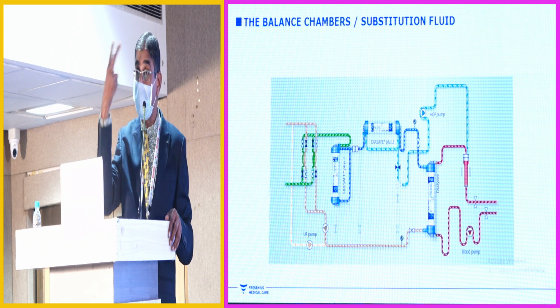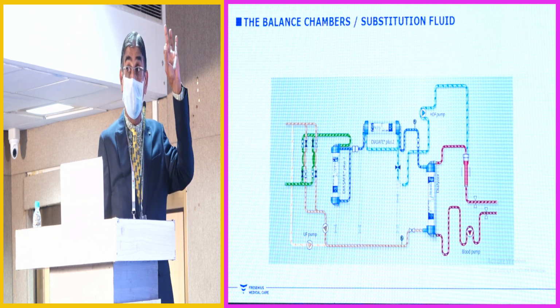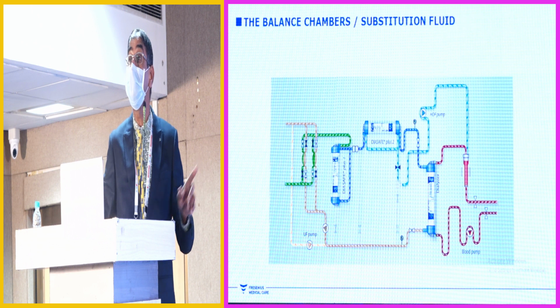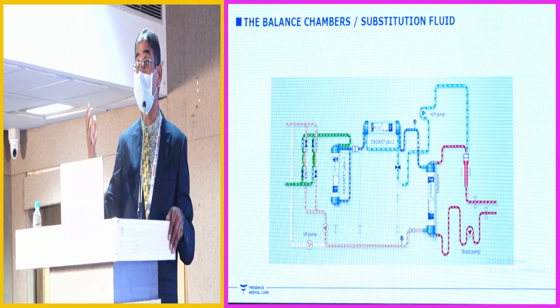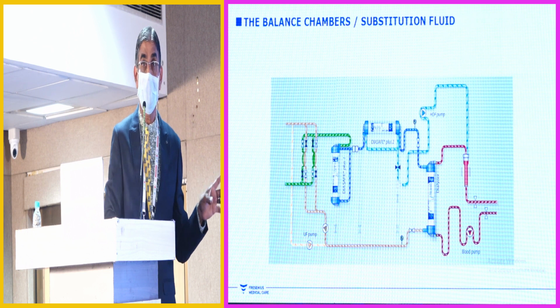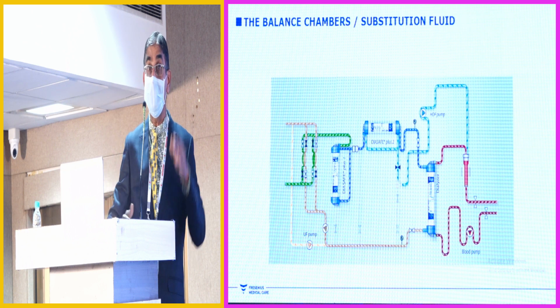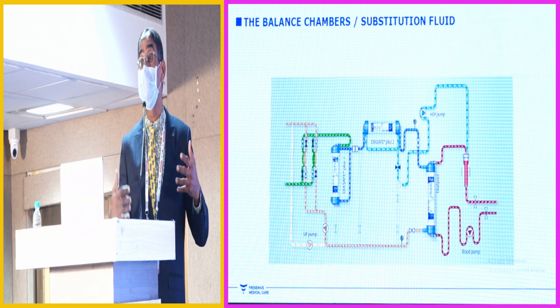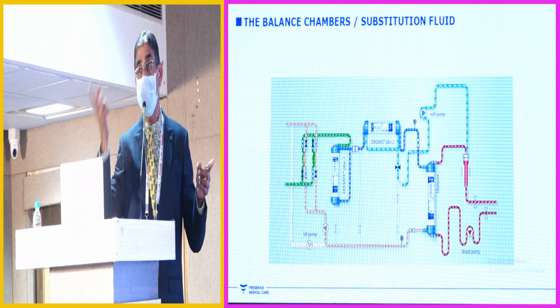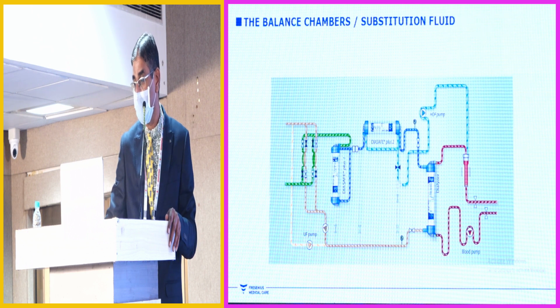What comes out of the second endotoxin retention capacity filter, the pore size is 0.2. After it comes out of the second endotoxin filter, it is going into this as a substitution fluid or a replacement fluid into pre-dilution or post-dilution. Thereby, in ISO document part 5, it states that it is already sterile and non-pyrogenic. Then why not use it for automatic priming? And we do it. That's the reason, a couple of slides before, I said you don't require an IV set and normal saline.